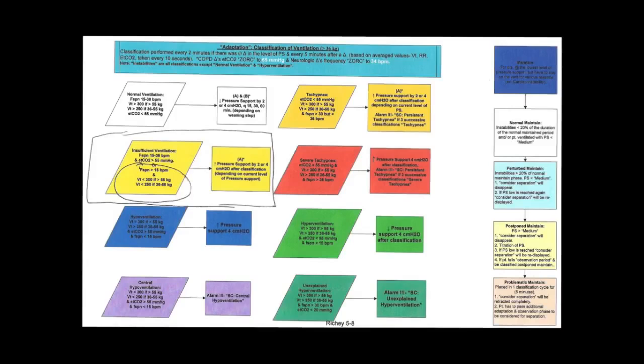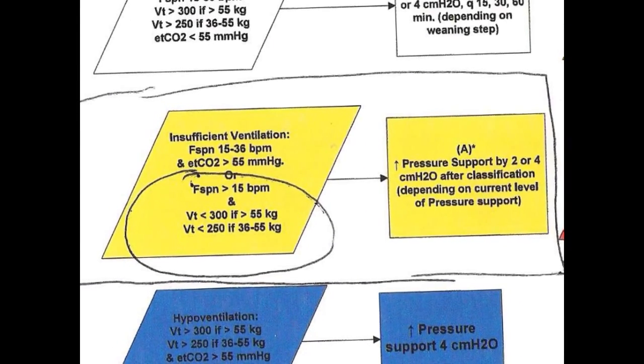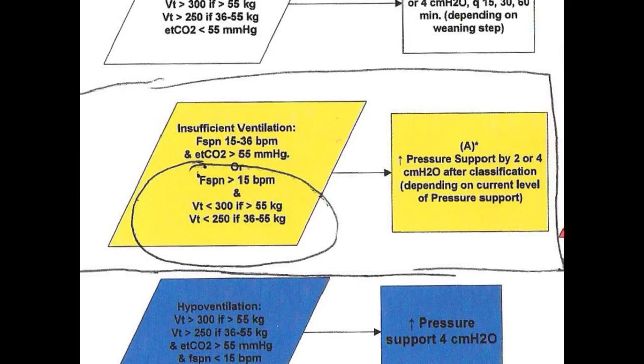Let's use the last patient as an example on just the regular pressure support. It's kind of already traced in pencil, but I'm going to highlight it in orange. And here's the example of the last patient I used on the traditional pressure support mode. I'm just going to enlarge this to make it easier to see, so we can see this classification and what SmartCare would have done.